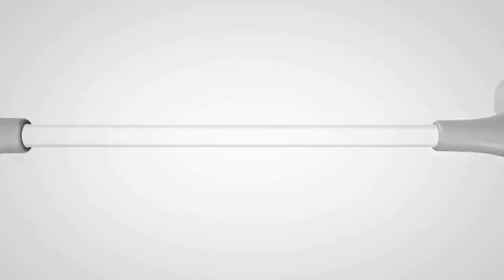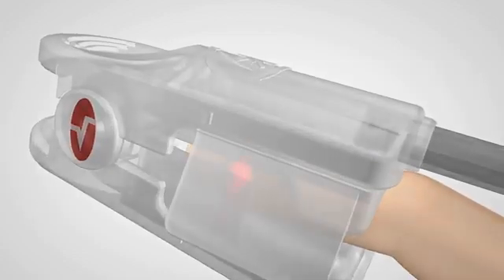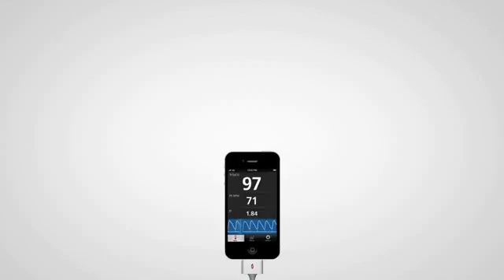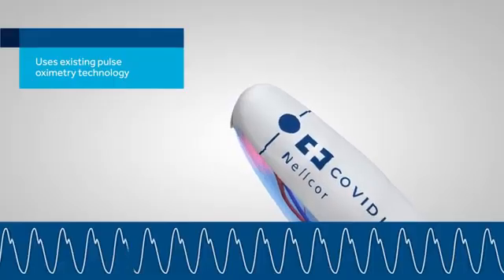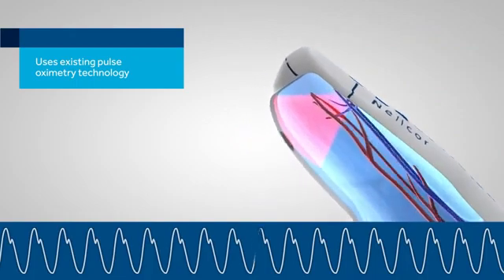Acceptable normal ranges for patients without pulmonary pathology are from 95 to 99%. For a patient breathing room air at or near sea level, an estimate of arterial PO2 can be made from the blood oxygen monitor's saturation of peripheral oxygen, SpO2 reading. Let's know about NIBP.